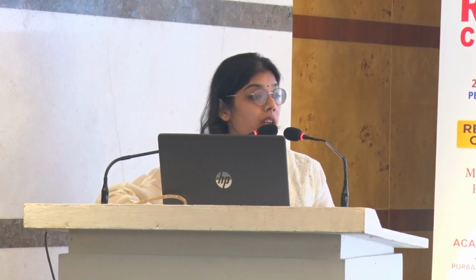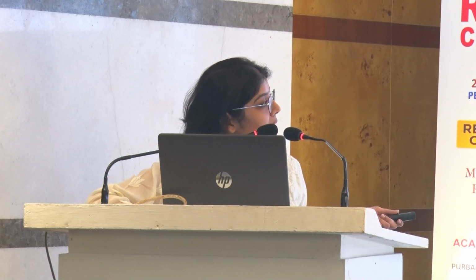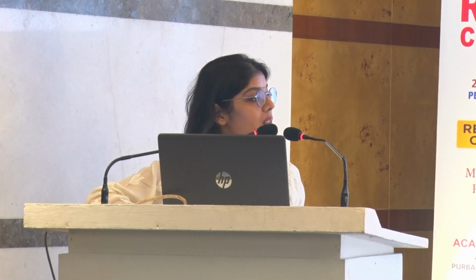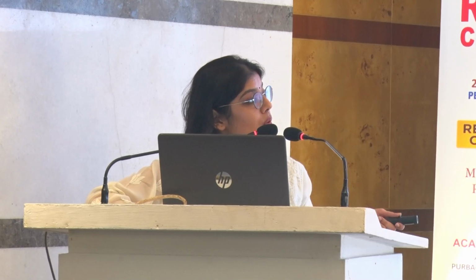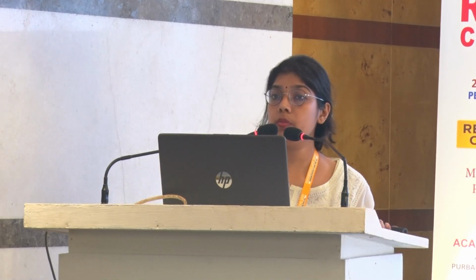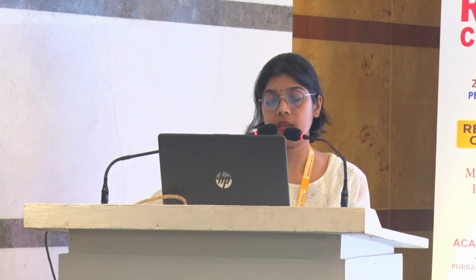This was a 50-year-old man with pain and swelling of the wrist joint, and on ultrasound we saw tenosynovitis. It was isolated fourth extensor tenosynovitis. This is the short axis view of the extensor digitorum, and it was quite vascular. So it could be infective, it could be because of early arthritis. That we can evaluate only clinically and with labs.